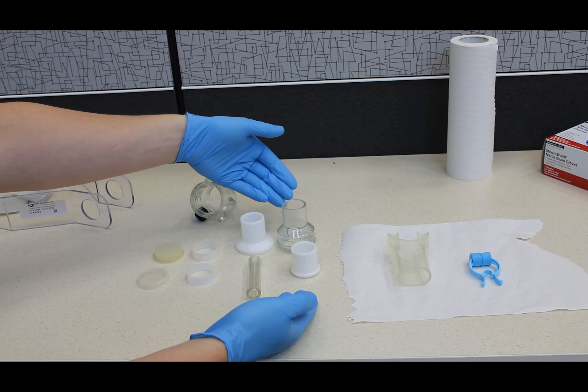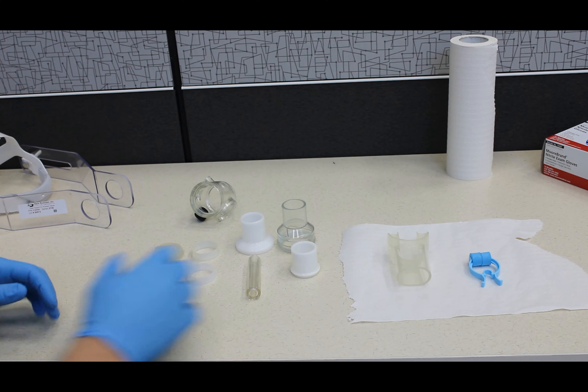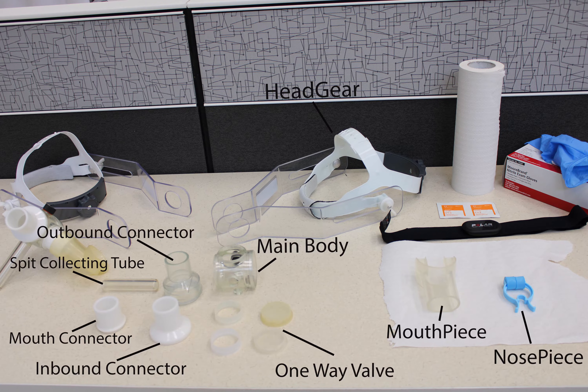First, let's familiarize ourselves with the headgear. You will assemble these pieces to create the headgear that the participant will wear during metabolic testing. These pieces include the main body, one-way valves, inbound connector, mouth connector, mouthpiece, outbound connector, spit collecting tube, and the nose piece.